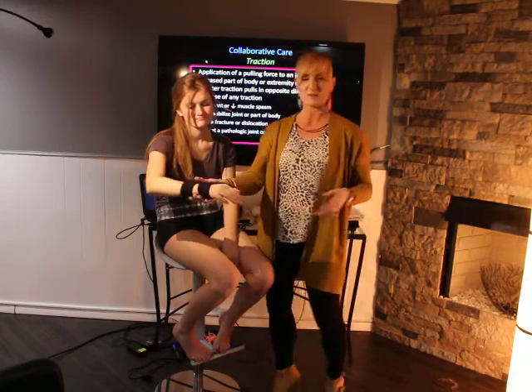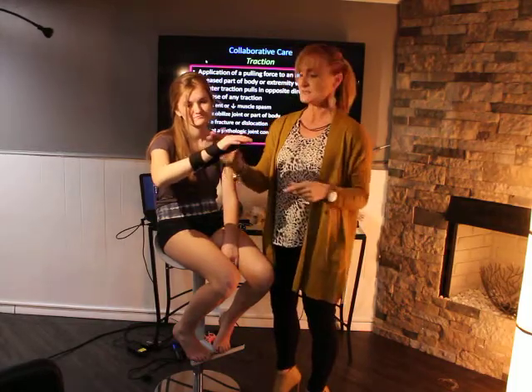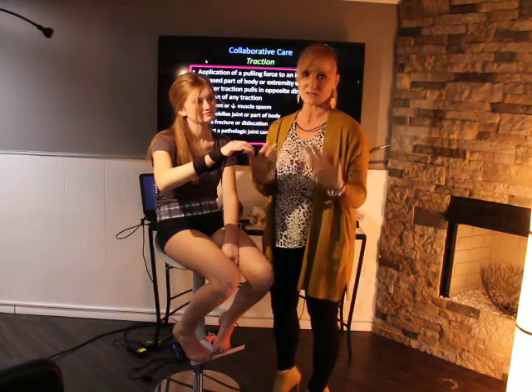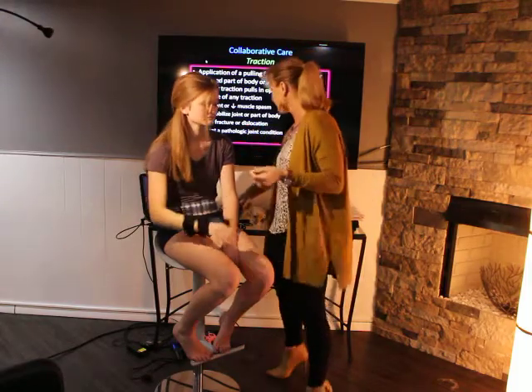You're going to want to wear the brace for maybe a week to 10 days. The nice thing about a brace, unlike casts, is you can take it off when you're getting in the shower, things like that, and then you'll teach your patient to put that back on. So that's one example of a thumb brace.